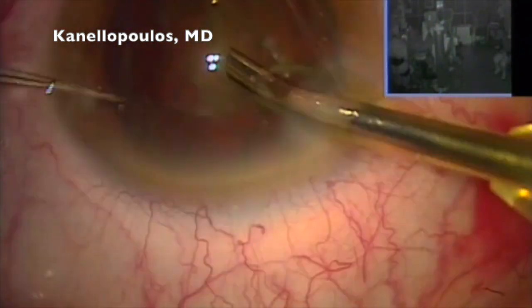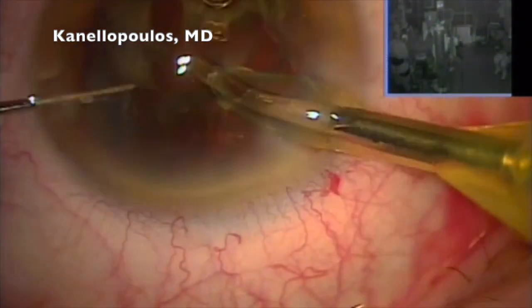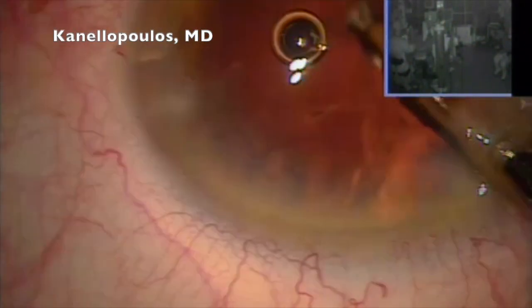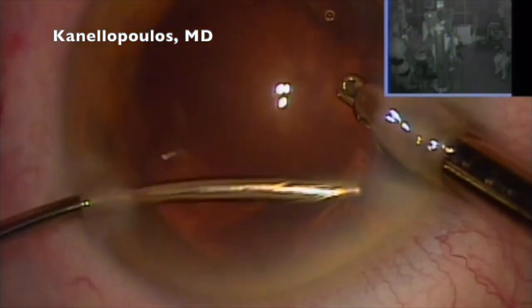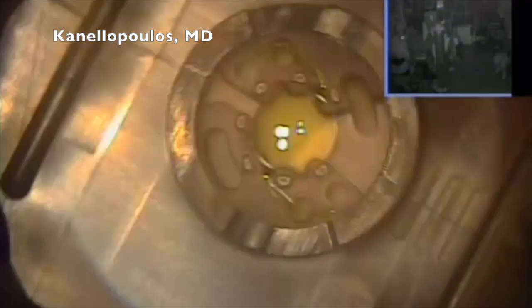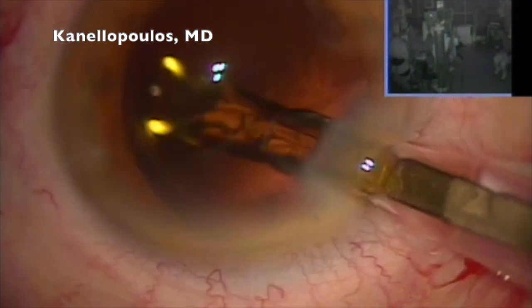Also, the surgical microscope was brought into ophthalmology by Dick Troutman, another Manhattan Eye, Ear, and Throat Hospital giant. From what I know, the two of them did not do very well together, but this is past history. We're both students. Actually, we are students of both of these giants of ophthalmology. We owe them so much. Again, here I'm cleaning up the residual cortex with my left hand. My piano lessons when I was in elementary school did help me a little bit in this regard. Again, bringing in the lens, I do this all by myself still, placing the lens.